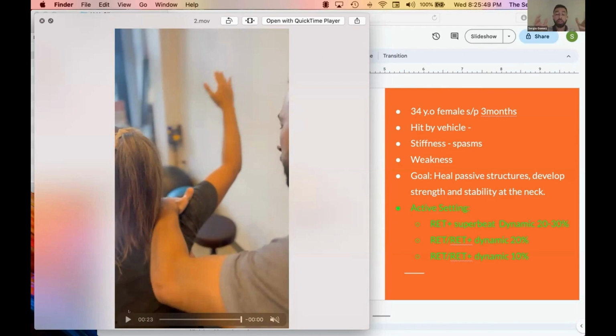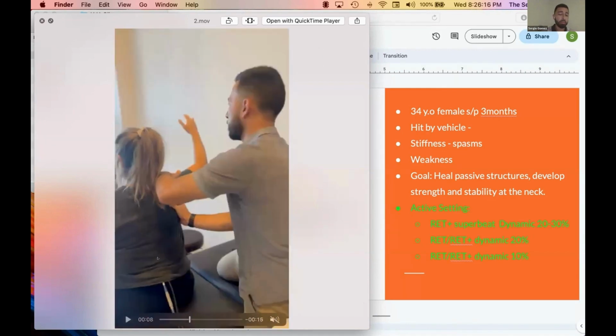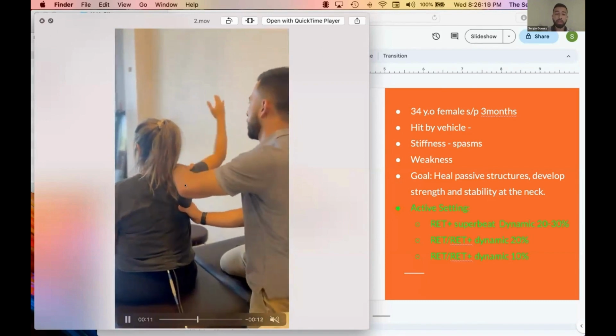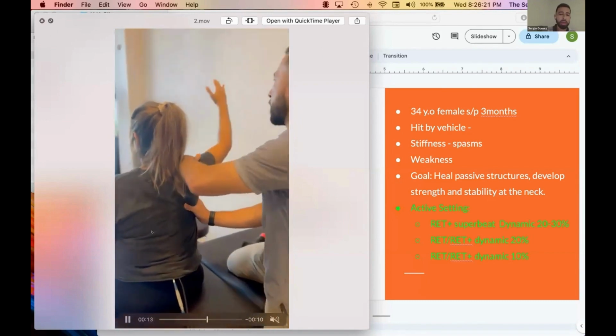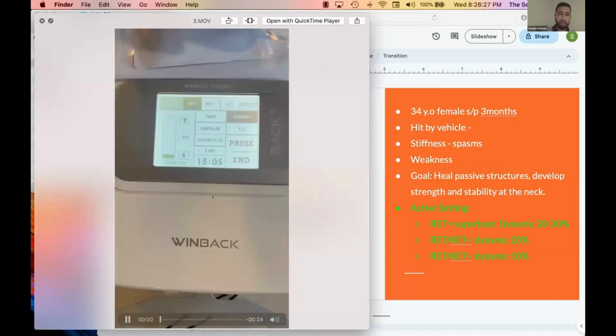There are certain structures in the cervical spine that we're going to have a really hard time stimulating to promote healing. The passive structures, the ligaments, the interspinous ligaments, even maybe the discs, right? And when we're thinking about the tendons, even of the muscles that were perhaps strained from the accident, these structures just receive that benefit, just by having the current running as you're running through any other manual technique. It could be with any PNF or any other muscular re-education. So on to the next one here.